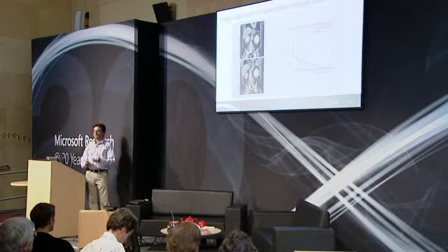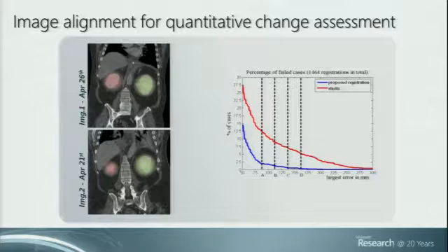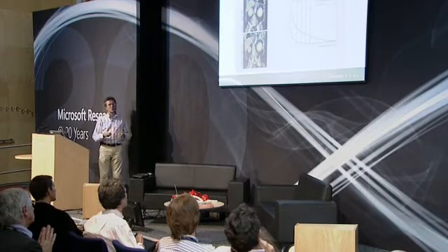And what we've done is, by training our system, by looking at a lot of data and using the probability of different organs being in different places, we can achieve this registration a lot more robustly than the state-of-the-art algorithm, which translates into much lower errors. This is the blue curve compared to the best state-of-the-art. In this case, lower means better.